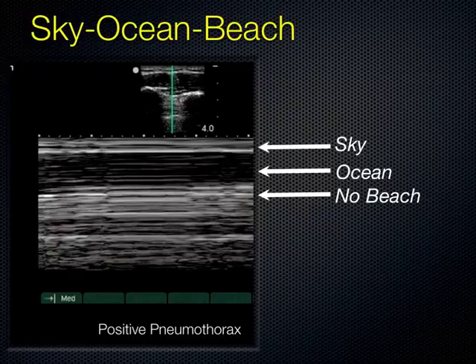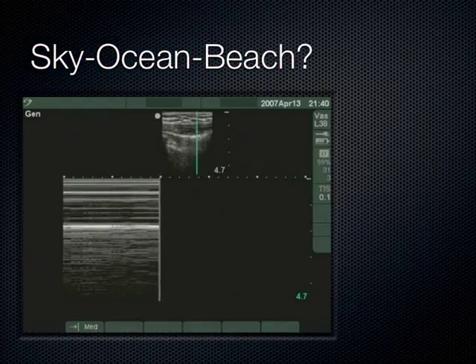Sky, ocean, beach. Nope, pneumothorax. Good job.